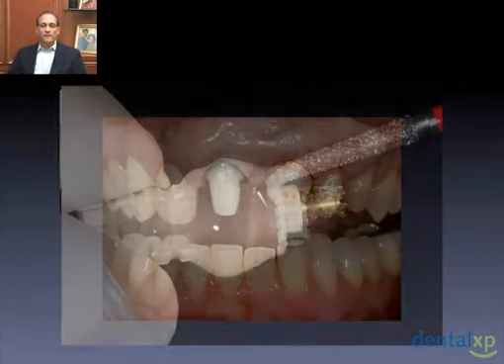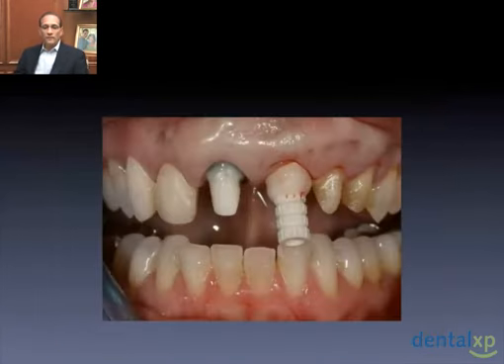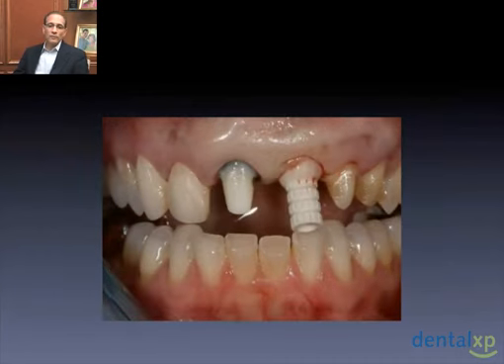When I start to bring these back to the mouth, I decide at this stage, as I'm beginning to insert it, and get a feel for whether or not the contour is too much, if it needs to be added to or taken away from, to get a more natural scallop and gingival architecture here. And as we push it to place, we see that really, from a soft tissue position, comparing to the other central incisor, we have achieved about the support that we want, both facial soft tissue and interproximal soft tissue, with the subgingival emergence of this provisional.